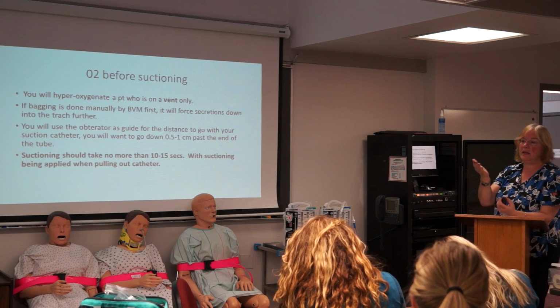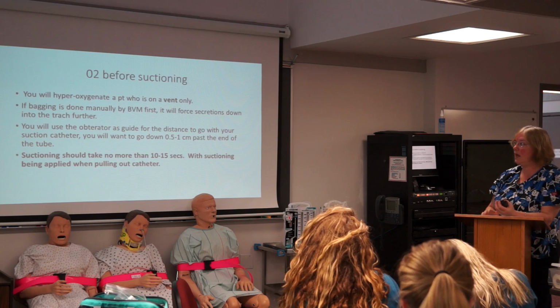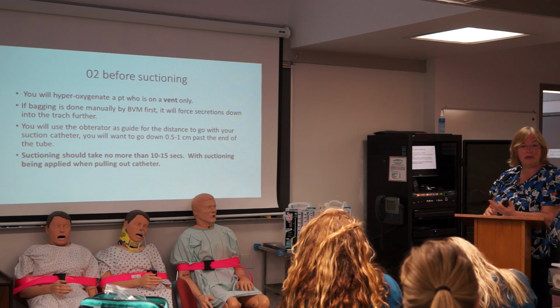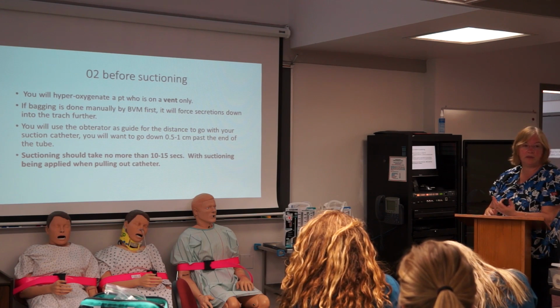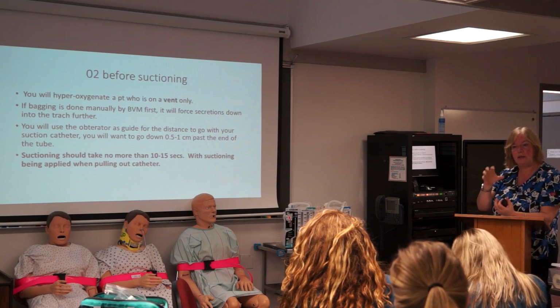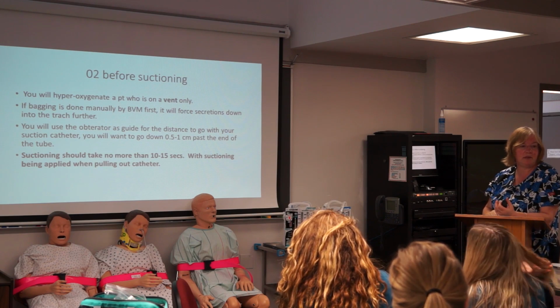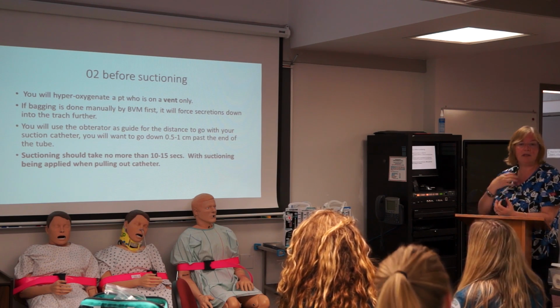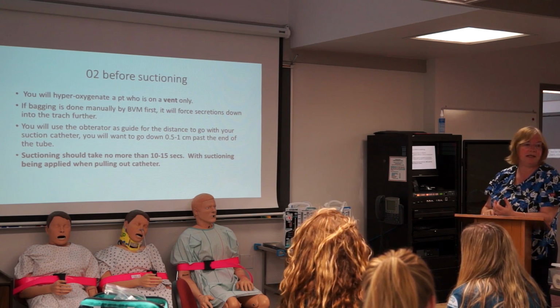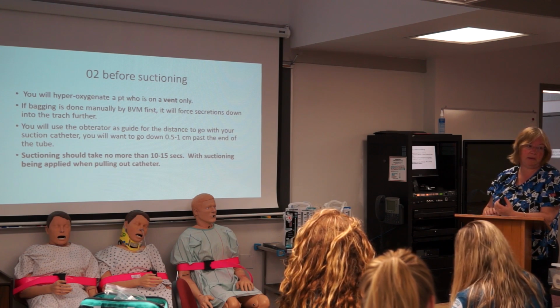If I have a patient that is not on a ventilator and we're going to come to the bedside, the only time I would bag a patient is if their SATs are extremely low and my patient is in really severe respiratory distress. Otherwise, if you think about what you're doing, if you bag valve mask a patient, as you see in some of your videos, you're going to force those secretions right back down into the lungs. Okay, so if the patient's got a strong enough cough and can get those secretions out, I'm going to try suctioning them first to get out what I can. And if my sats are still low, then I'm going to bag valve mask my patient. Okay.